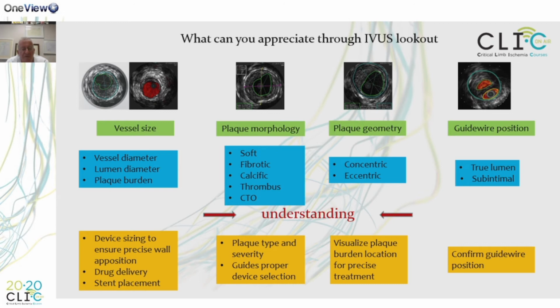underestimated by angiography. The degree of plaque asymmetry within the vessel is one of the most appreciated factors in the context of treating vascular disease with interventional devices. The shape of the plaque cannot be fully appreciated, even with biplanar angiography of the diseased segment. One of the main advantages of IVUS is the ability to objectively assess plaque morphology, and this has several implications for the treatment of peripheral vascular disease.